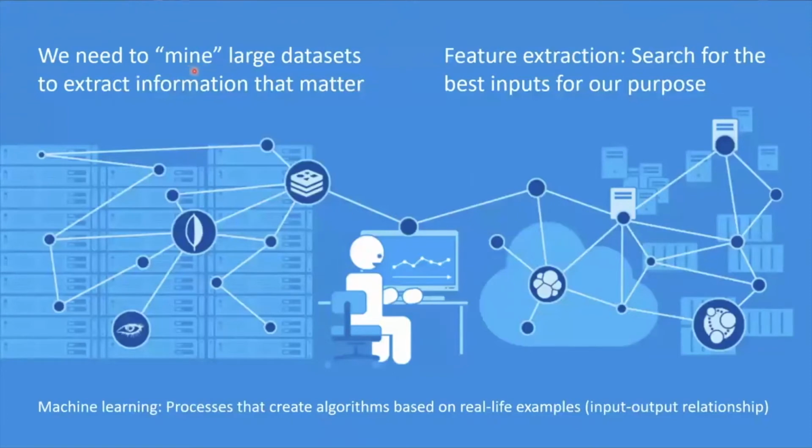Now, more related to the Hexoskin, its algorithms already do a really good job in terms of translating the raw signal from the sensors into second-by-second physiological variables, such as heart rate and pulmonary ventilation, which in fact saves us a lot of time because this initial feature extraction process is sometimes complicated due to noise and movement artifacts.